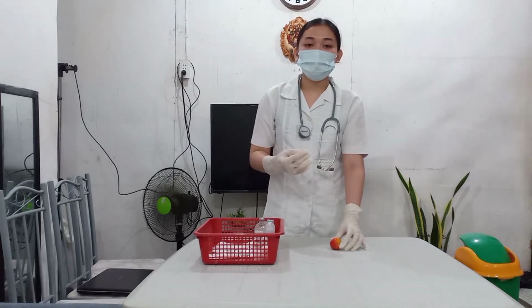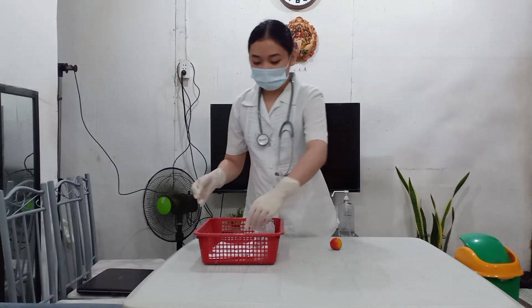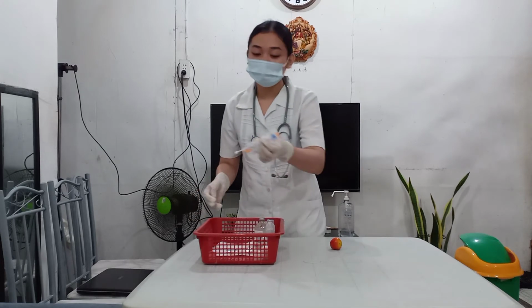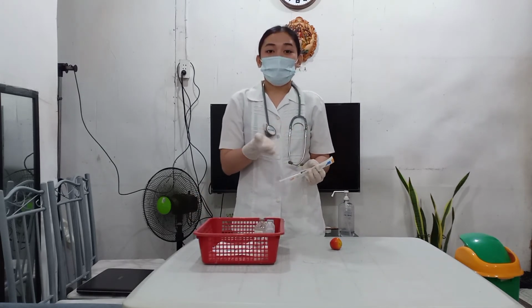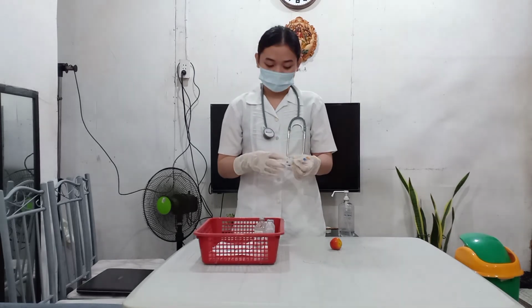After which, we will then remove the needle cap while waiting for the antiseptic to dry, because alcohol gives full play to disinfect after dried. So, I will remove the needle cap from the tuberculin syringe which we prepared on the previous procedure.